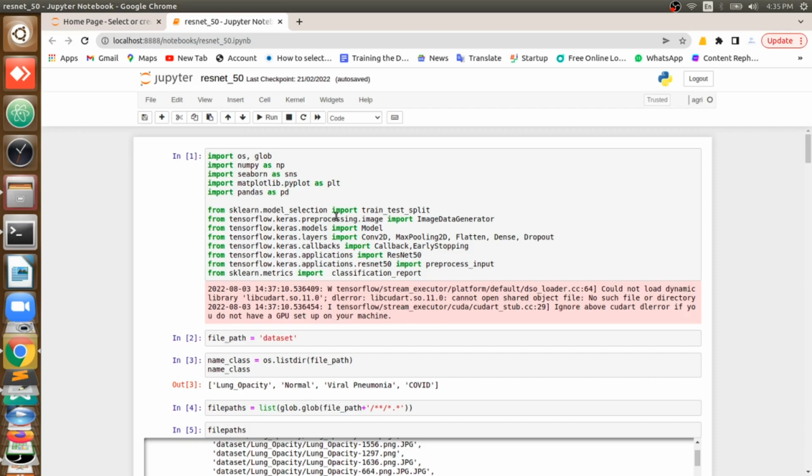All these inner organ related diseases are very hard to predict. Even if we get scanned images, maybe MRI images, maybe CT scan images, any type of scan images, it's very hard for a doctor to recognize the particular area for treatment, the particular area for the decision. Why? Because the disease on the images will sometimes be mimicking something. It will not be real, it will be some other infected part.